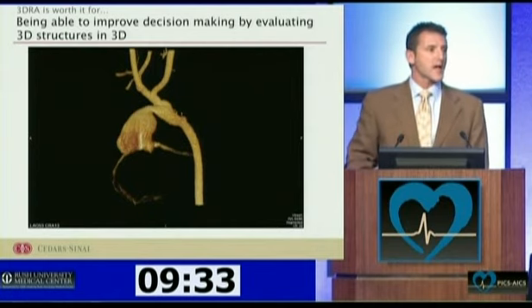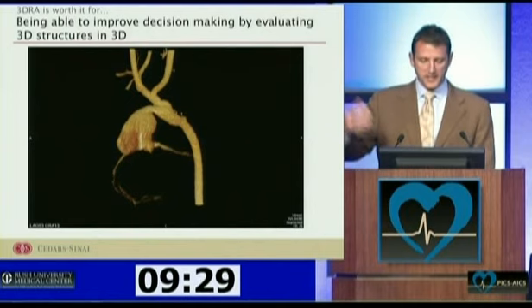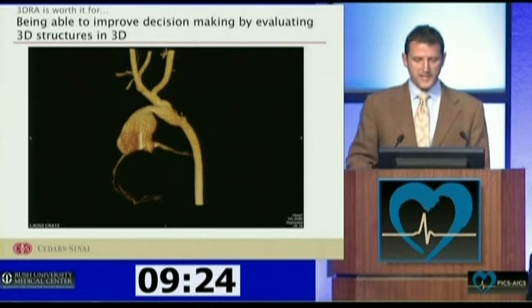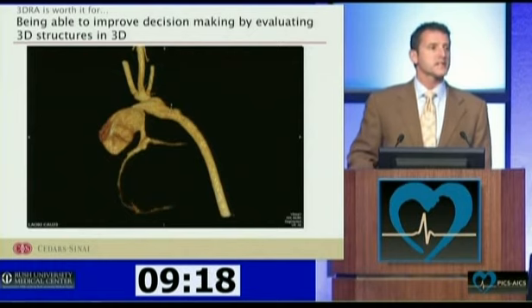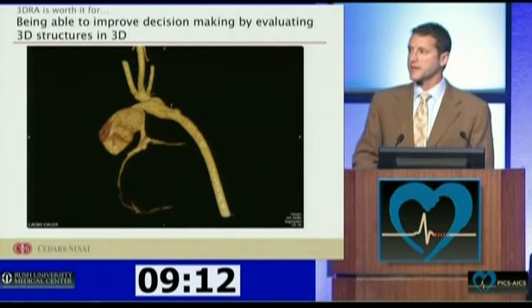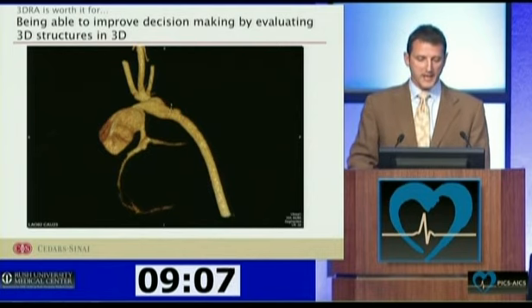So she came to the lab, and you know, we've sort of made a whole lifestyle out of stenting kids like this, little babies who have complex problems, and let's put a stent in and fix it. But this one kind of spooked me, and when I saw the 3D RA, I was real worried about how this particular lesion interacted with the native tiny ascending aorta, which acts as basically a single coronary for her, and that single takeoff of her head and neck vessels.